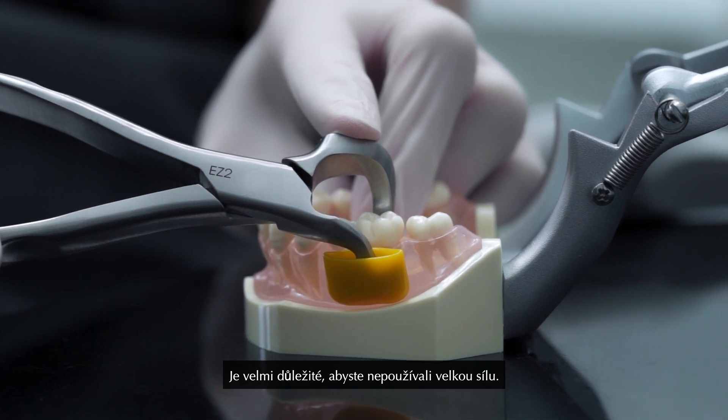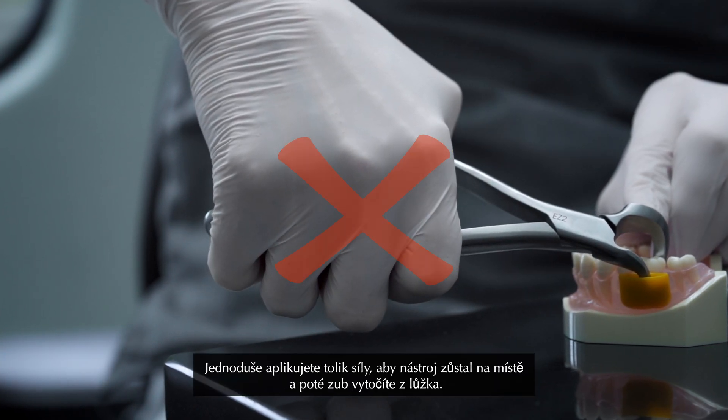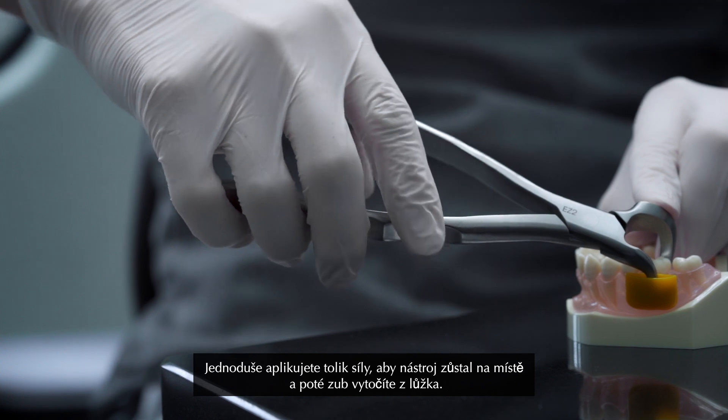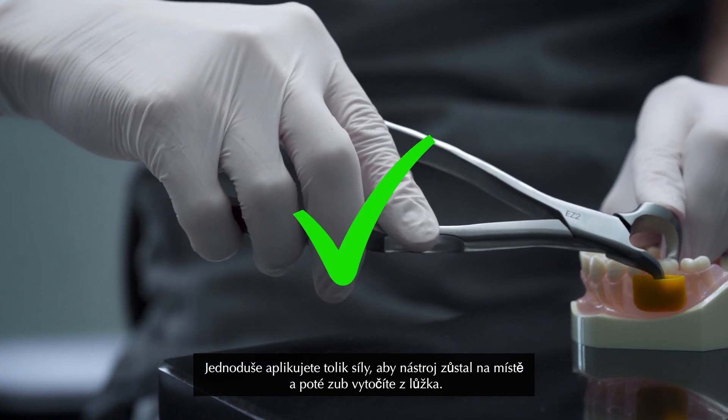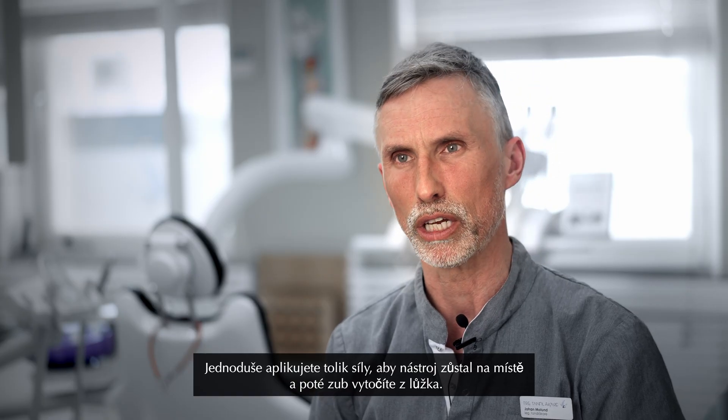It's very important that you don't apply large force. You simply apply as much force for the instrument to keep in place and then you rotate the tooth out of the socket.